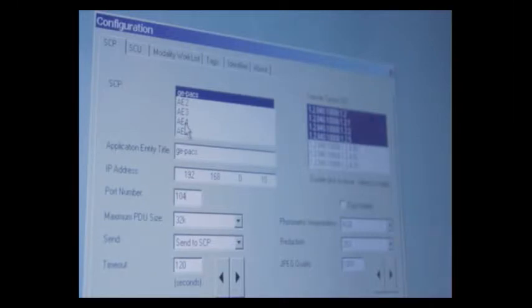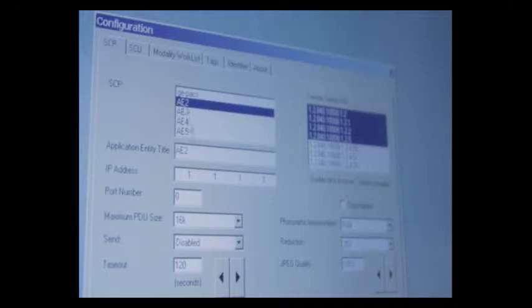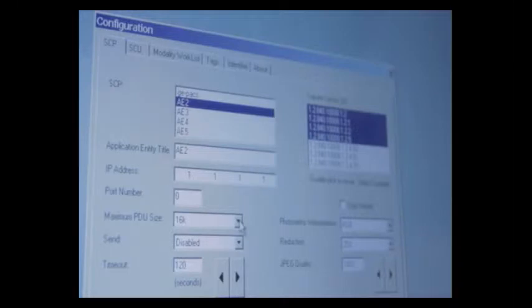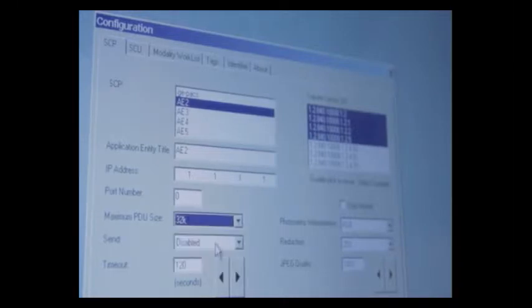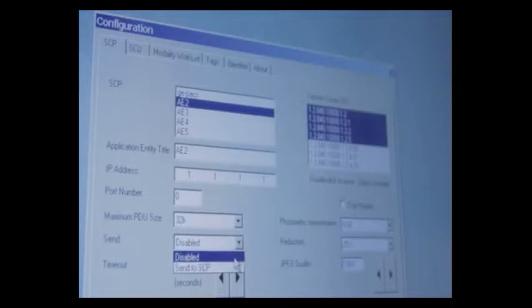Now you'll notice up here we have the ability to send to a number of different image send DICOM systems. So if you have a redundant backup server, you can simply enable AE2, type in the AE title of that one, the IP address, port number, change the maximum PDU size to 32, and enable the DICOM send.